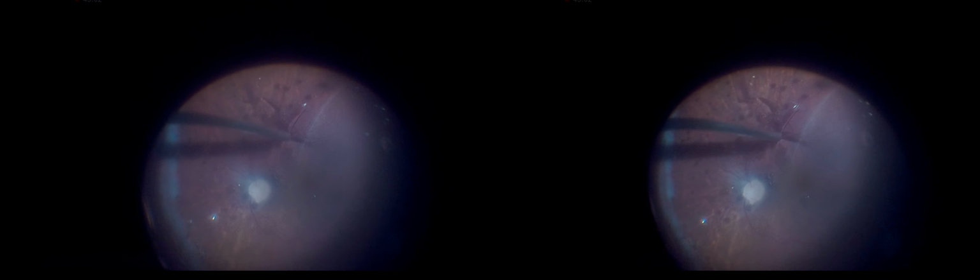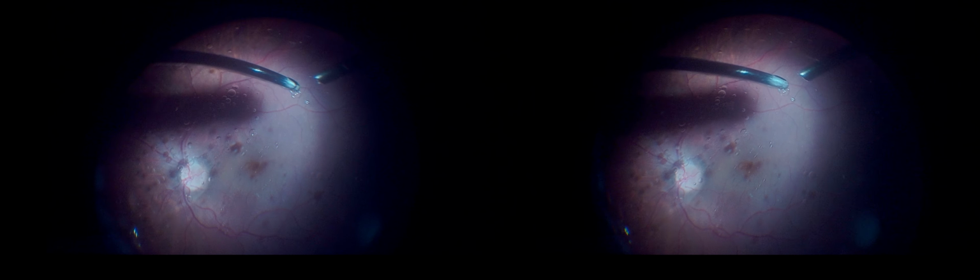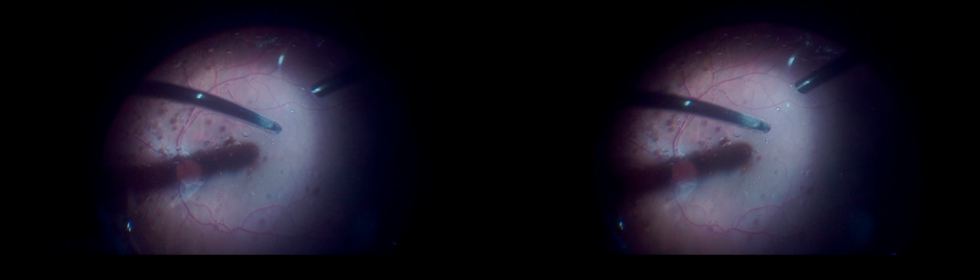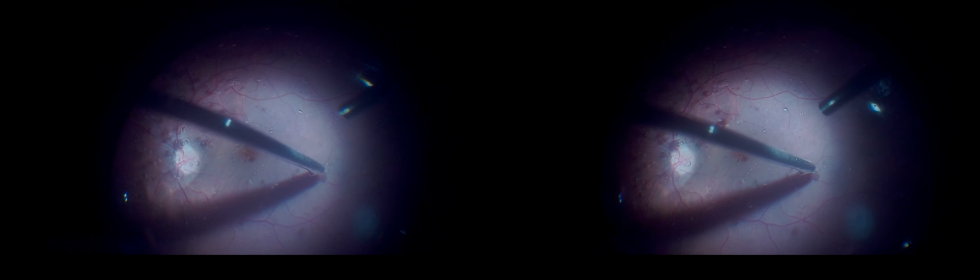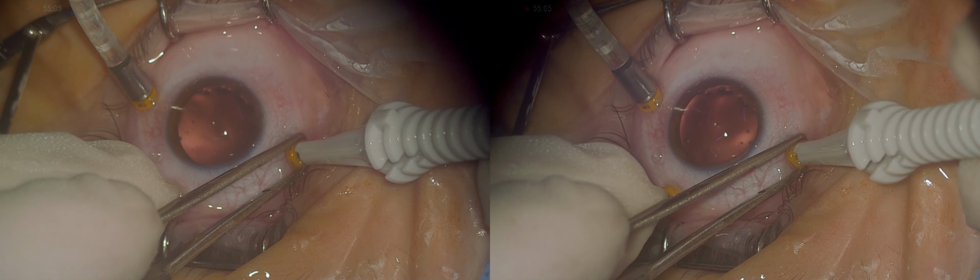The retina is fully attached. There is no retinal slippage or subretinal PFC by the end of the exchange. Sclerotomies are removed by the end.